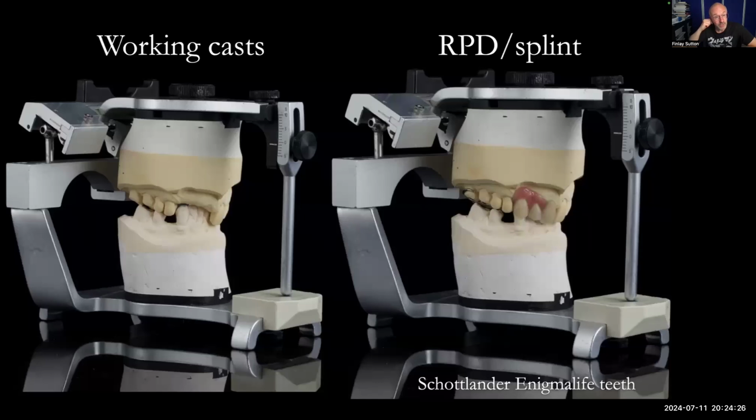No, actually, no. I use soft tissue undercuts too. So this area here will be helping to retain it as well. Mustafa, on that area, absolutely, both is the answer to your question.